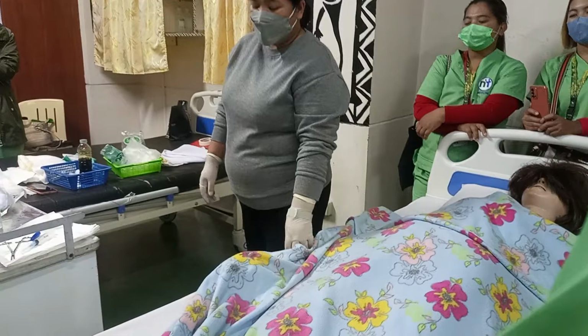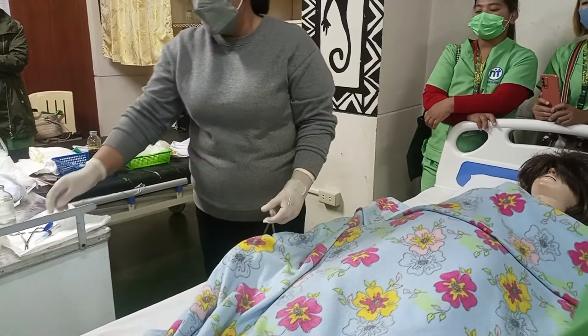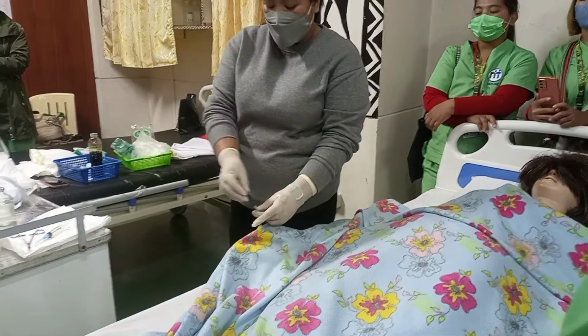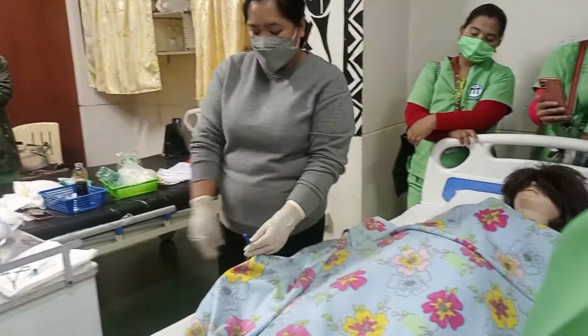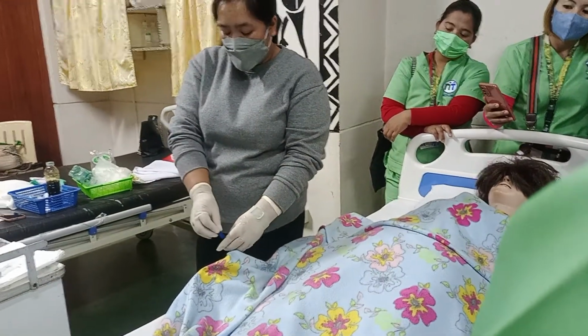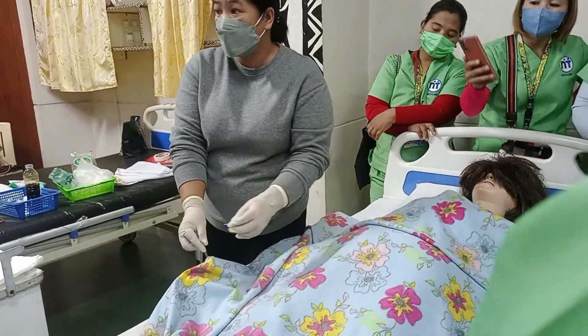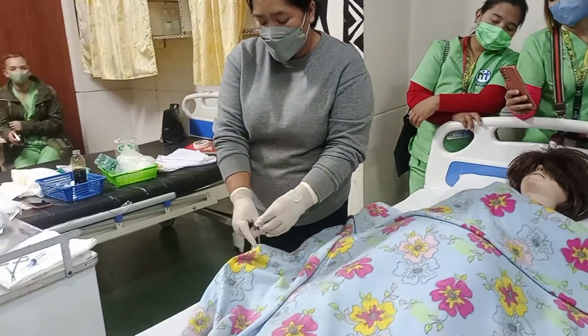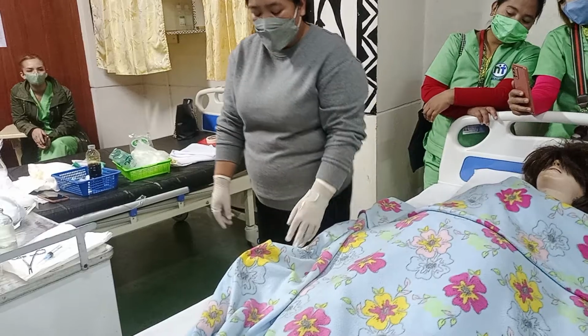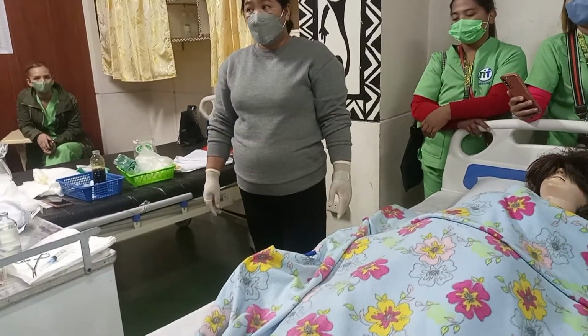Basahin natin doon sa doctor's order kung ilang oras yung pagitan. Kasi, for example, the doctor asked me to lock. Okay? Use the takip of your urine bag. You lock that, you kink. Ang tawag dito, if you're going to fold it, that's kink. So, you kink the urinary bag tube. Let's say, sabi ni Doc, i-kink ninyo ng 1 hour.